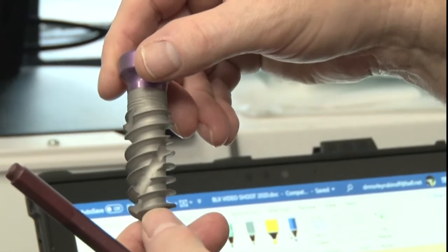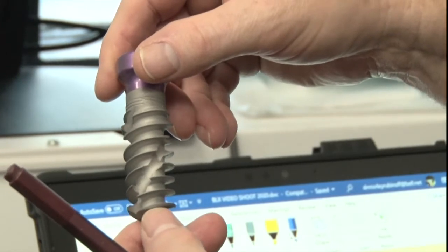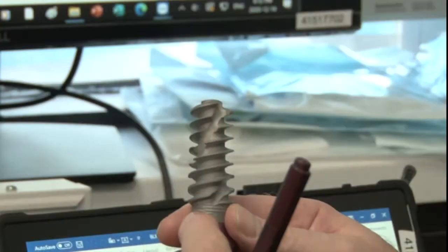So the purpose of this is that as the implant gets screwed into place, all the bone that gathers gets pulled along this channel and up towards the top. And since a socket is generally more narrow here and wider here, it deposits new bone at the widest part of the funnel, which is an excellent way of growing bone, if bone is necessary, at the cervical alveolar crest.